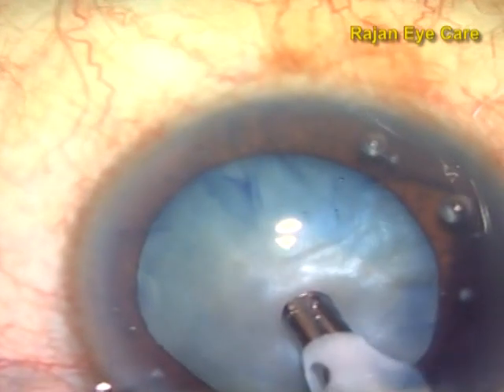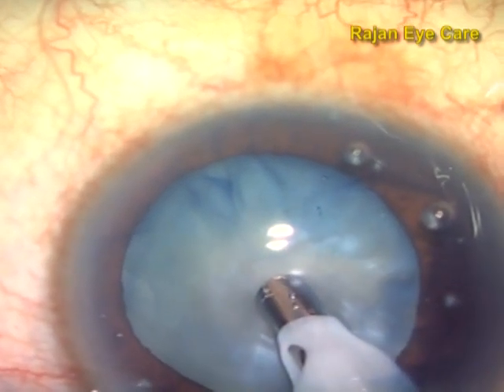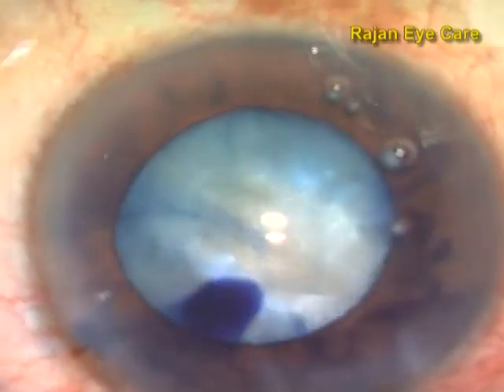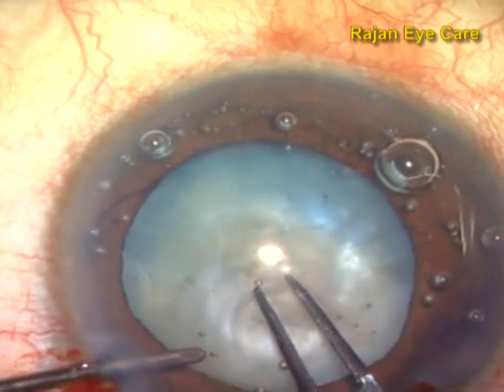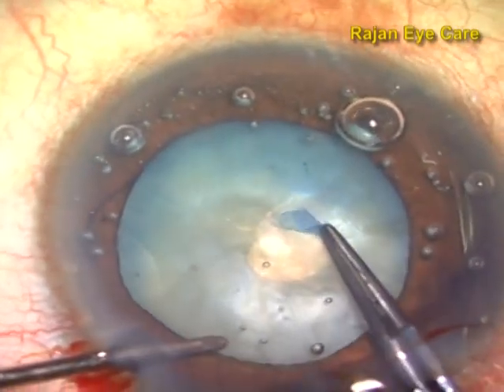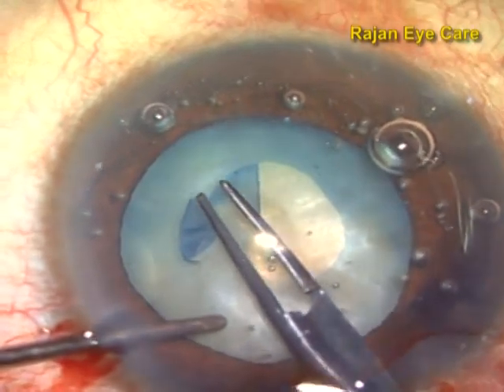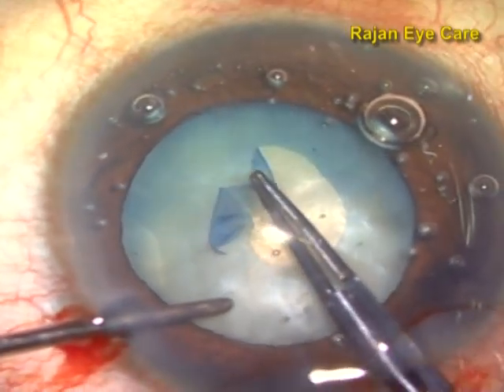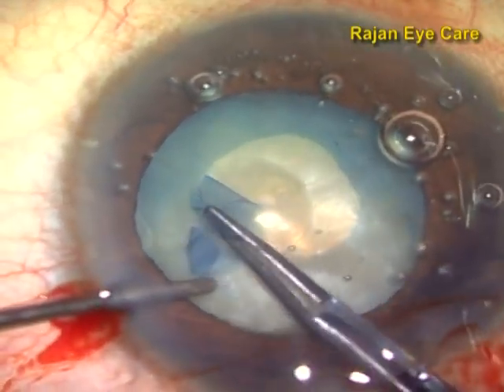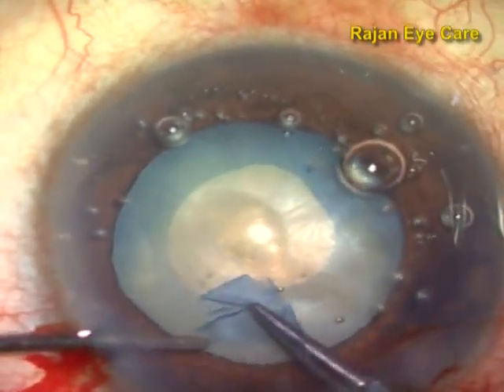In this video, you can see I am using a straight tip, 15-degree, bevel down, going into the center of the capsule, and then giving a punch. This technique is called panchorexis. Once you make a punch in the anterior capsule, there is sudden decompression, and because of that there is no tendency of the capsule to extend to the periphery, thereby preventing an Argentina flag sign.